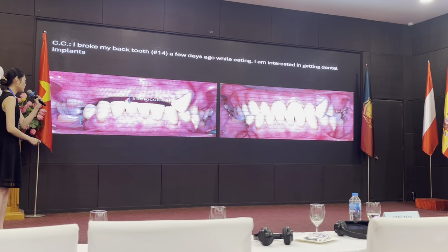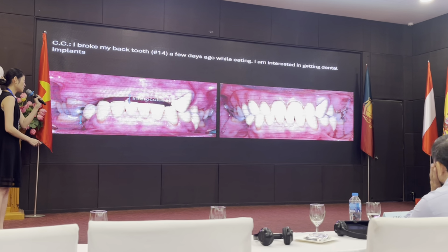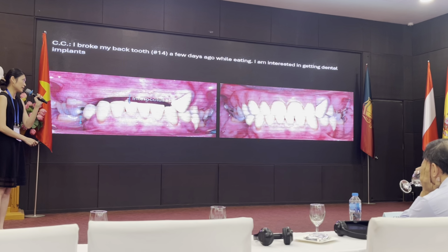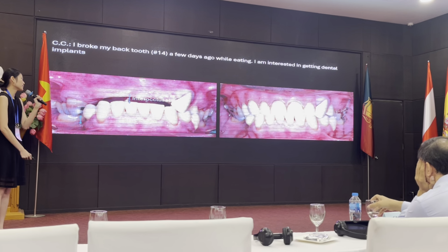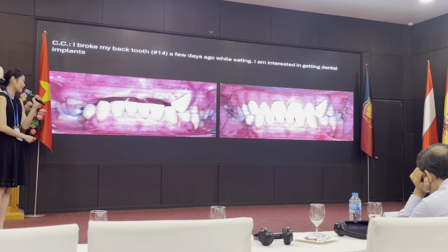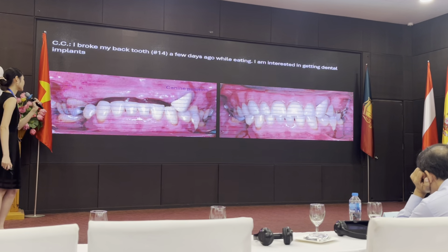And this is how the patient presents with a partial denture. So the patient doesn't raise the vertical dimension. We still keep the tooth contact in the posterior. And another thing the patient doesn't like is the canine position. He feels whenever he smiles, the canine looks really high.